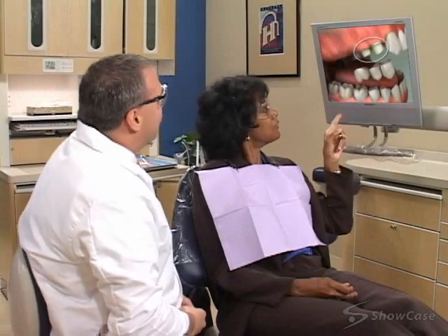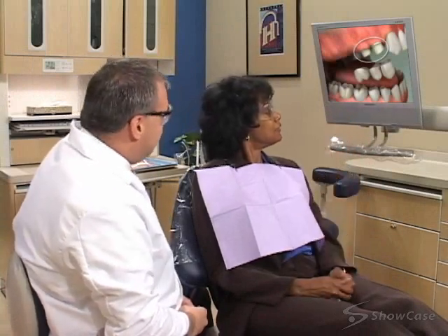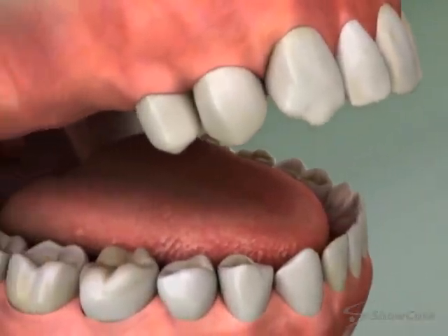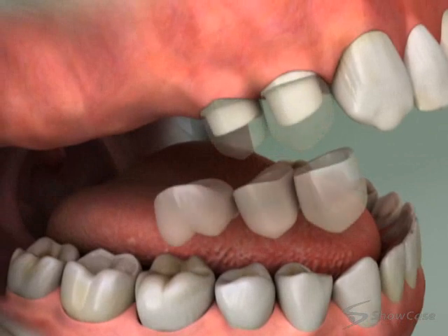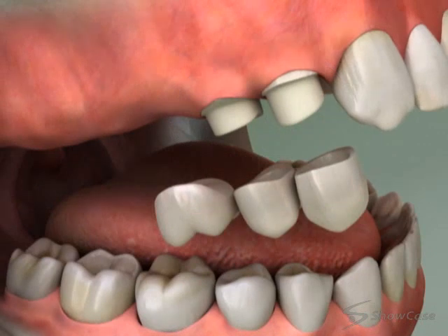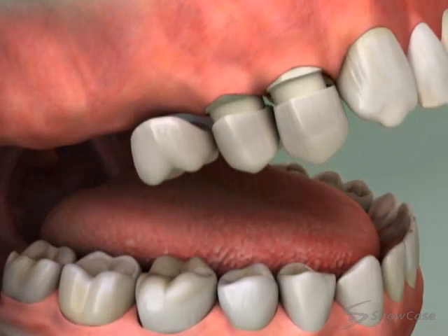When a tooth is missing, a cantilever bridge can be a good choice for replacing it. Like all bridges, the artificial tooth in a cantilever bridge uses the support of neighboring teeth to stay in place. But unlike traditional bridges, a cantilever bridge attaches to teeth on only one side of the space.